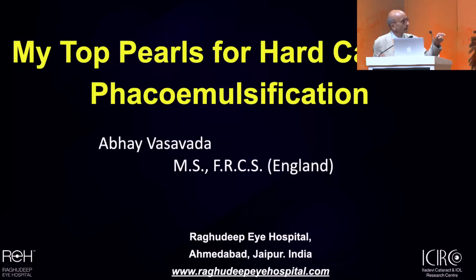I just want to comment on what Gaurav said. Please listen. I think femto is a very good technology to make the incision. Why? Because you can titrate the width of the external incision separately from the internal. What I do is a truncated incision, 2.2 millimeter outside, 2.3 millimeter inside, and that I cannot do manually or any other way. So please, you have the best machine. Please do that. Thank you.